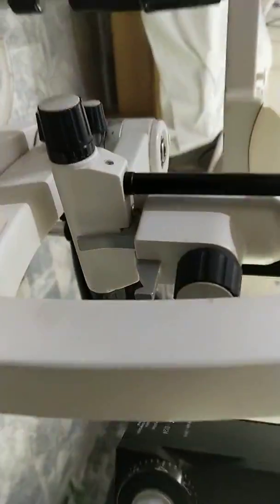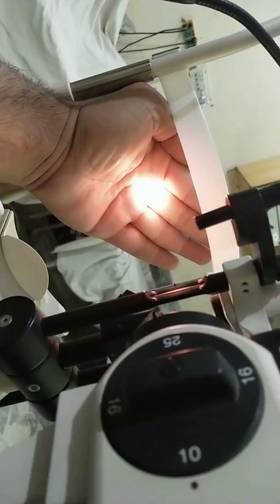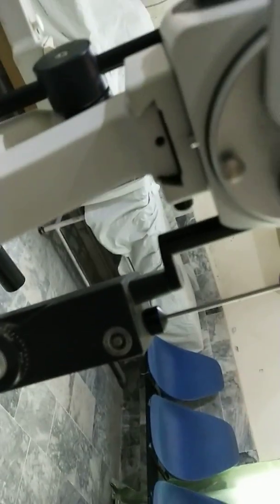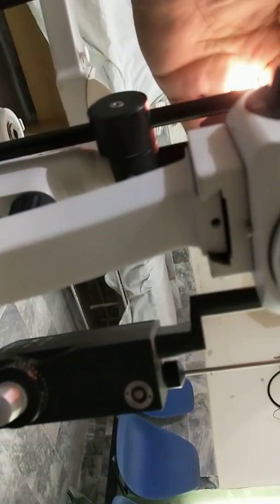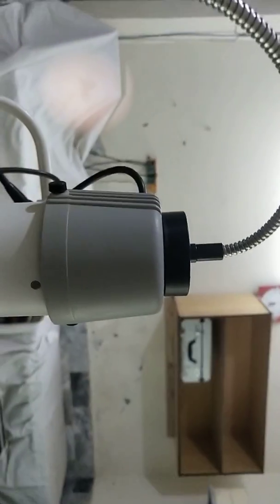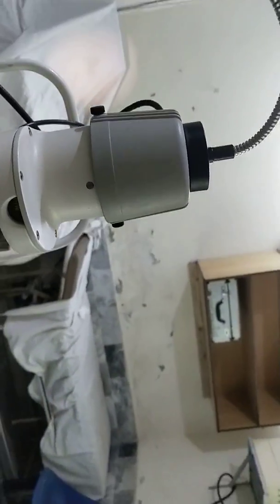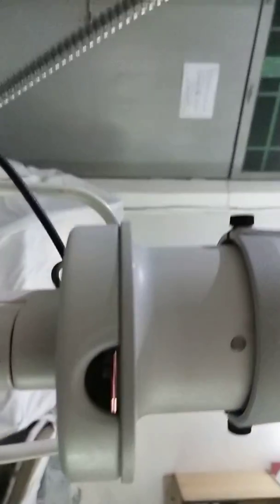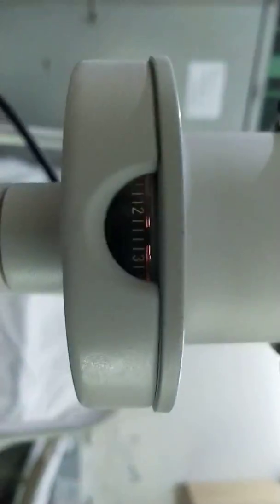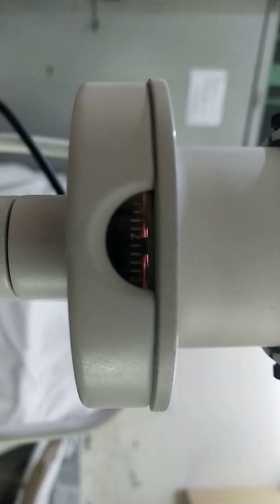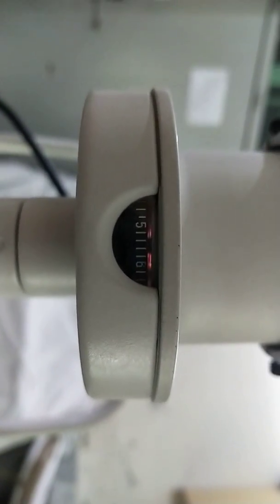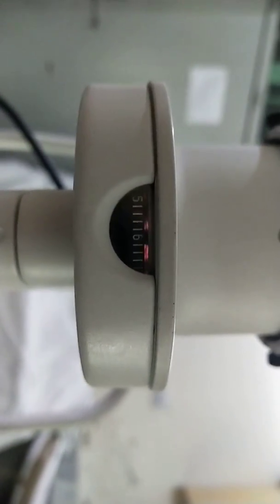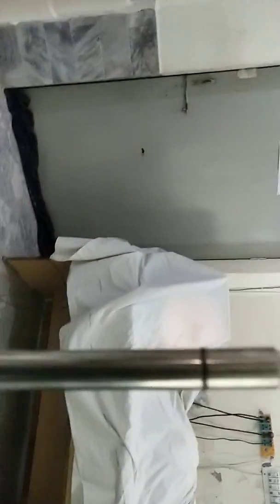If you see this is the slit. And here is the illumination bulb. You can see the vertical width here, how much it is. Here two millimeter, three millimeter, four millimeter, five millimeter, that's the length of the vertical slit.